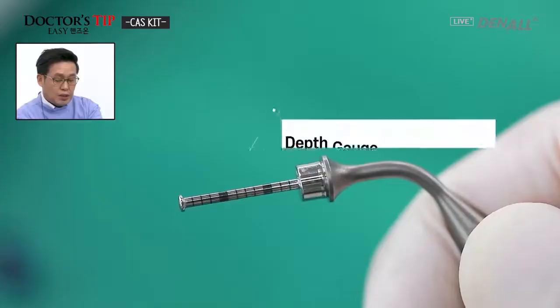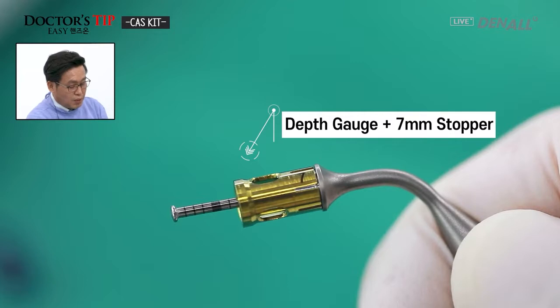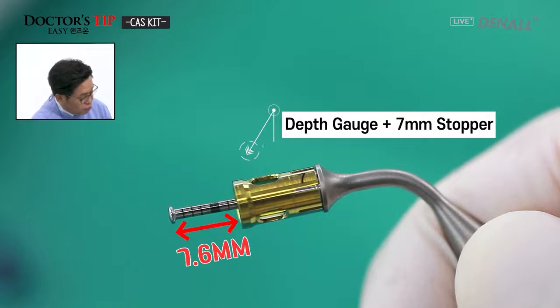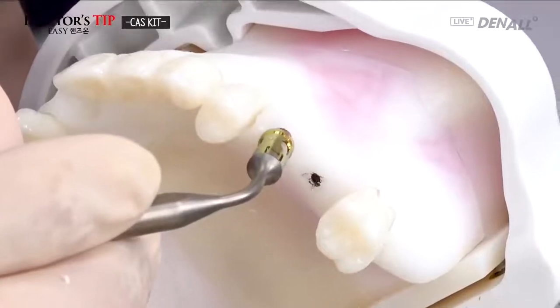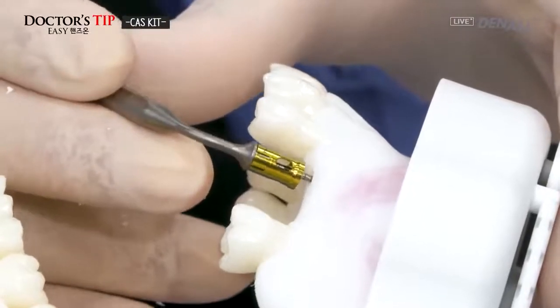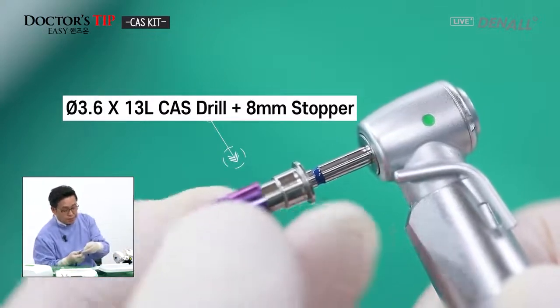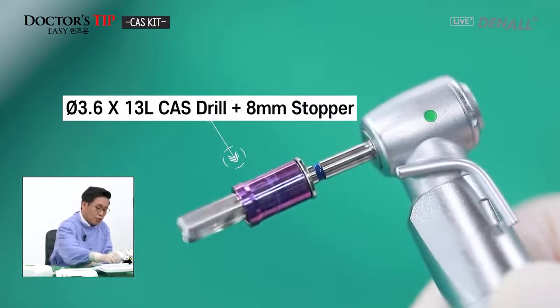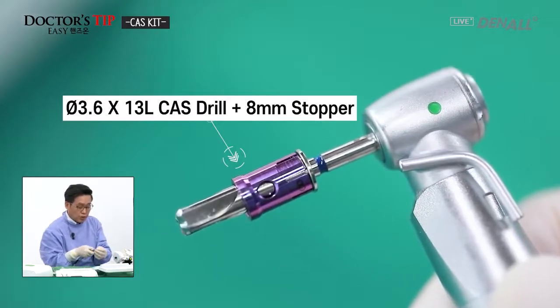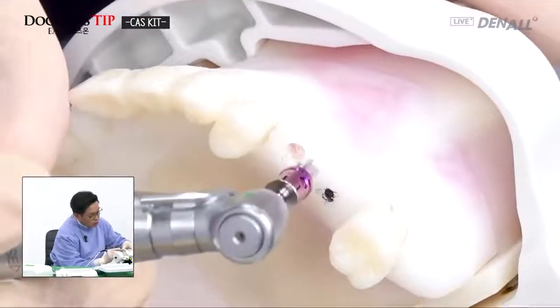Now I feel it is being penetrated. The 7 mm stopper is connected to the depth gauge. When it is connected, a 7.6 millimeter protruded portion is observed. The sinus floor is not yet penetrated. We thought it would be 5 millimeters. We use up to an 8 millimeter stopper because the sinus floor is sloped and the alveolar bone itself is also sloped.